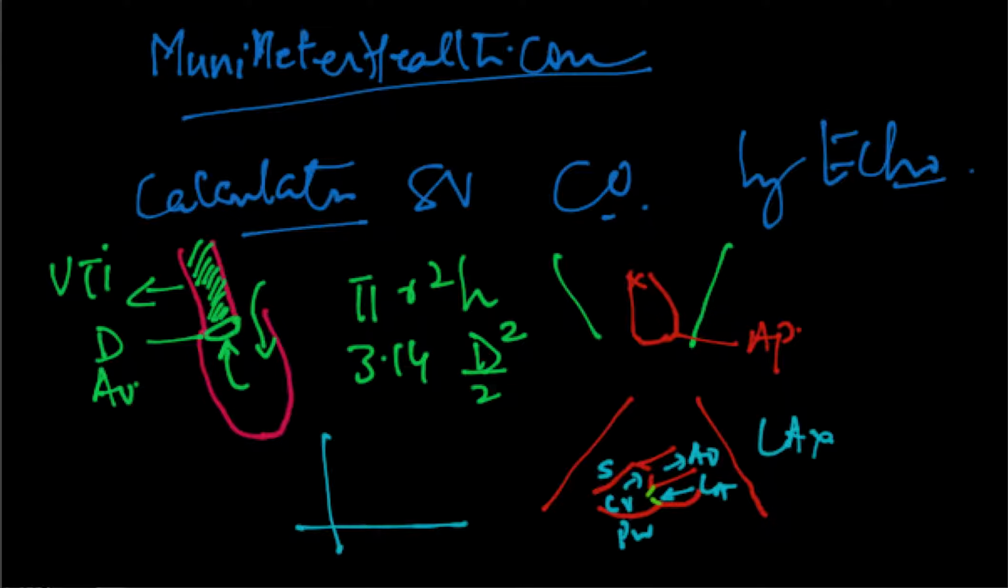So we want to really record what looks like a velocity time integral in this fashion. And as the Dopplers are being recorded and you click at that level, mind you, you might get some weaker signals here and weaker signals here. You don't want to take that, so those will be disregarded. So disregard these, but take the darkest signal, which is the biggest signal, I call it, and that becomes your VTI, and that's in centimeters.